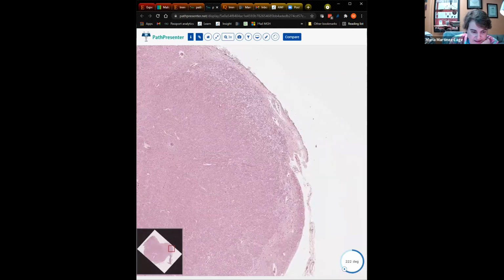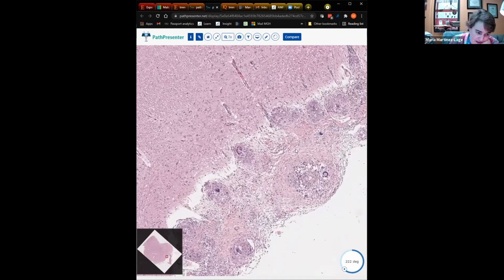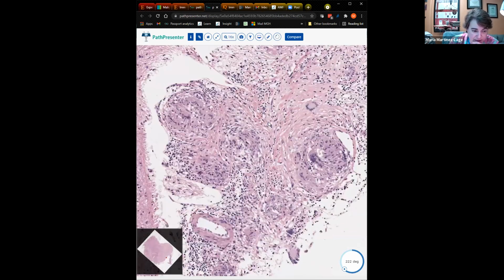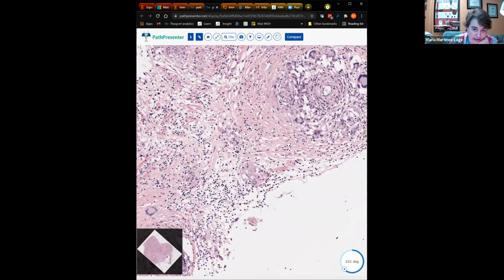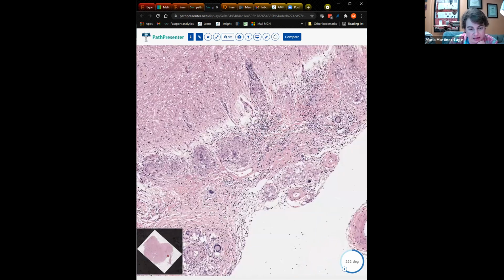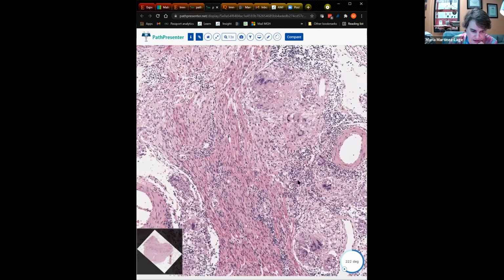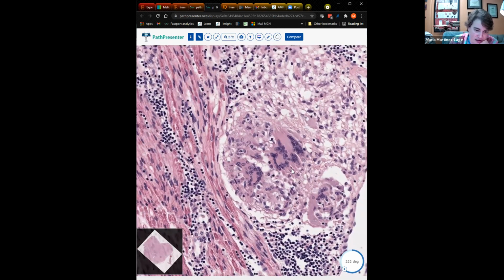We suspect that's probably the same thing that's going to be happening here, in which we were seeing that there's expansion of the leptomeninges again. Very good examples of epithelioid granulomas with multinucleated giant cells. So granulomatous meningitis is what we're seeing here. The question is, what is the etiology for these? You should definitely consider fungal infections, mycobacterial infections. Similar to any other locations in which you may have a granulomatous inflammatory process, you want to rule out mycobacteria, you want to rule out fungal, whether it's aspergillosis or histoplasma or all other things.